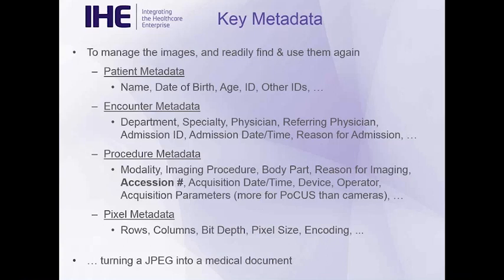There's the encounter metadata that this imaging was associated with. So what department was this taken in? What specialty? Who was the physician? What was the admission ID or admission date? Some of these other proxy identifiers. What is the reason for admission? Again, useful for trolling through large collections of images.